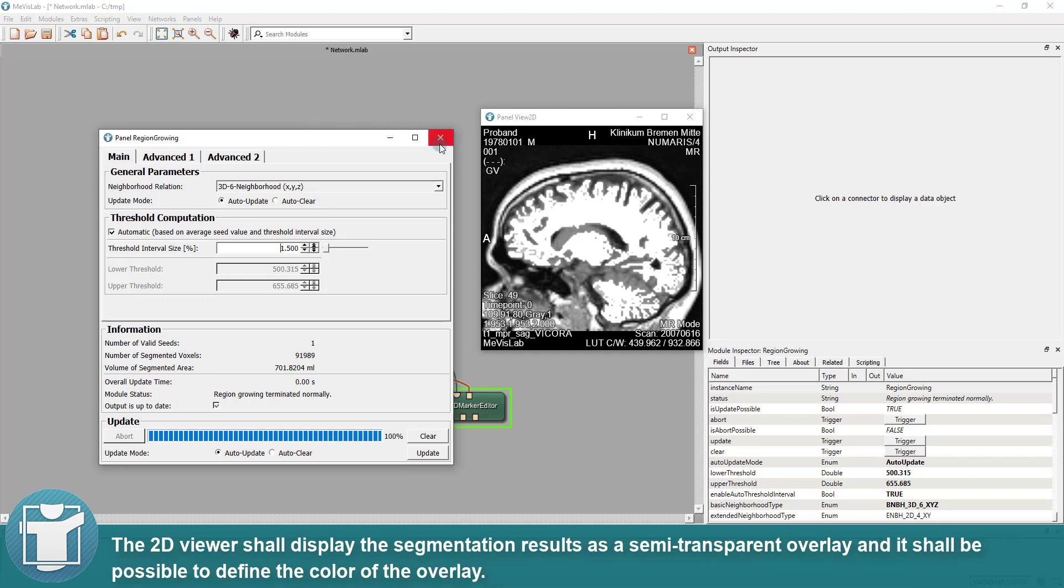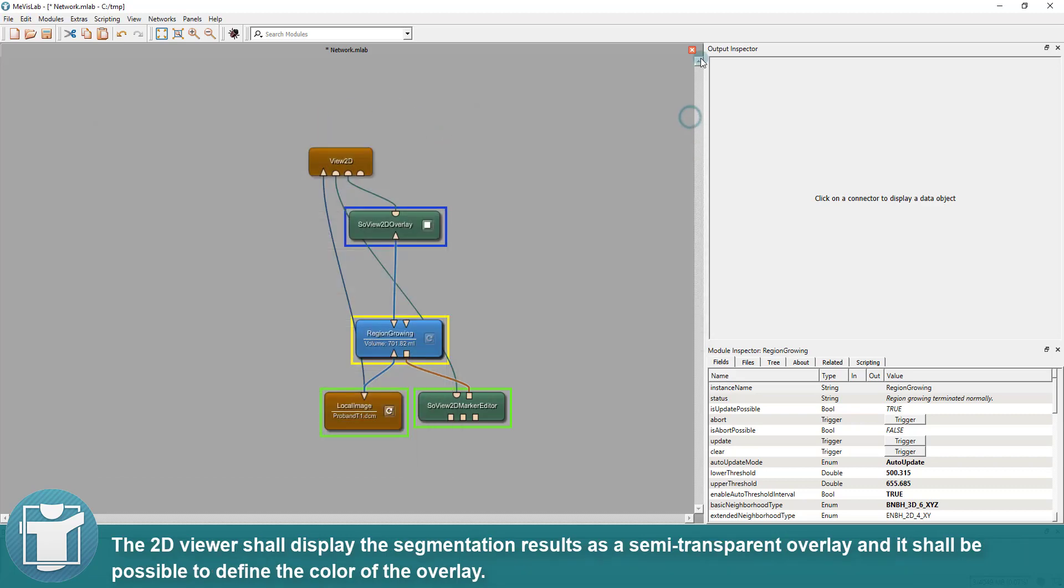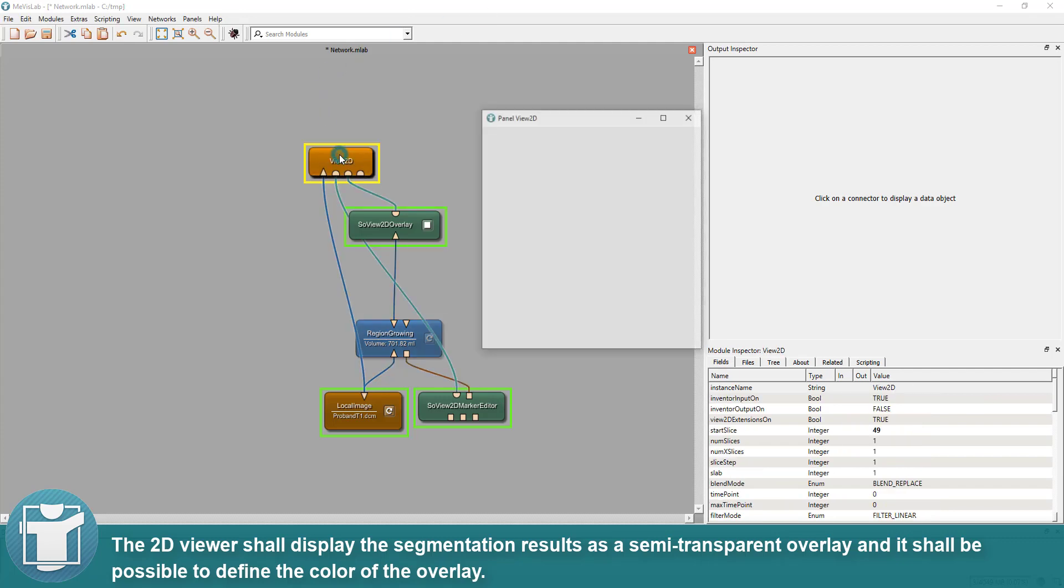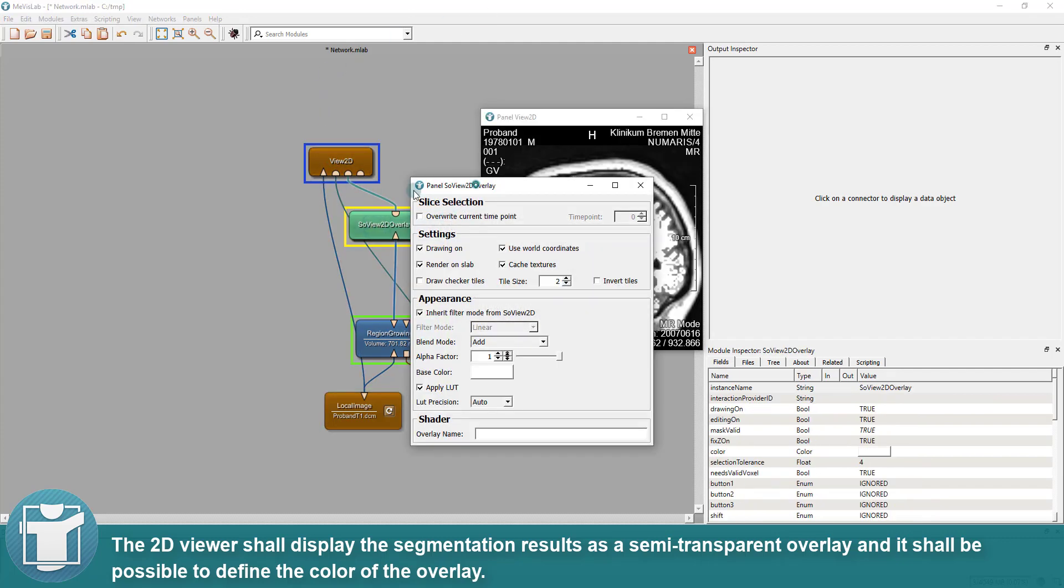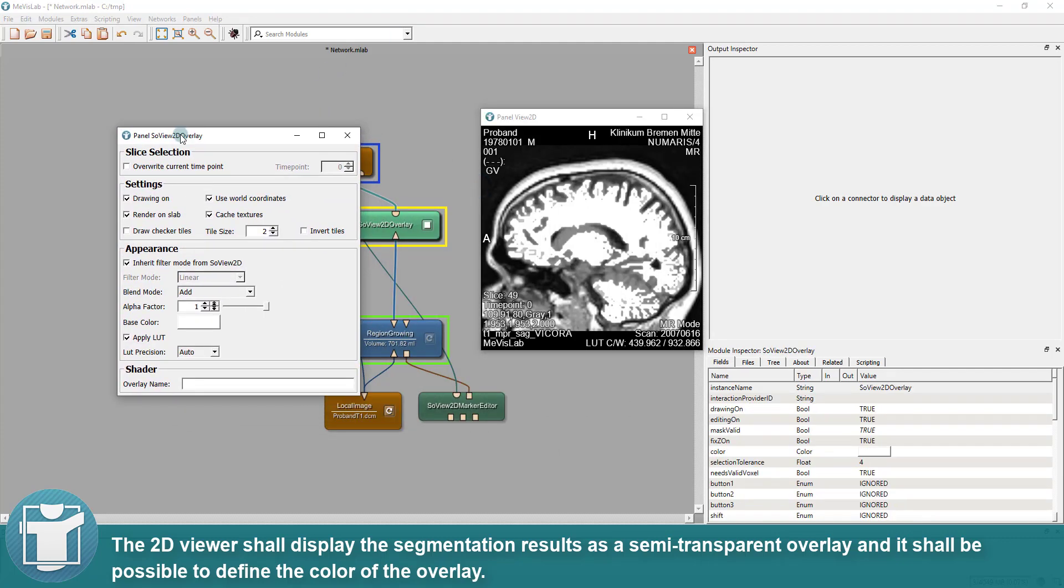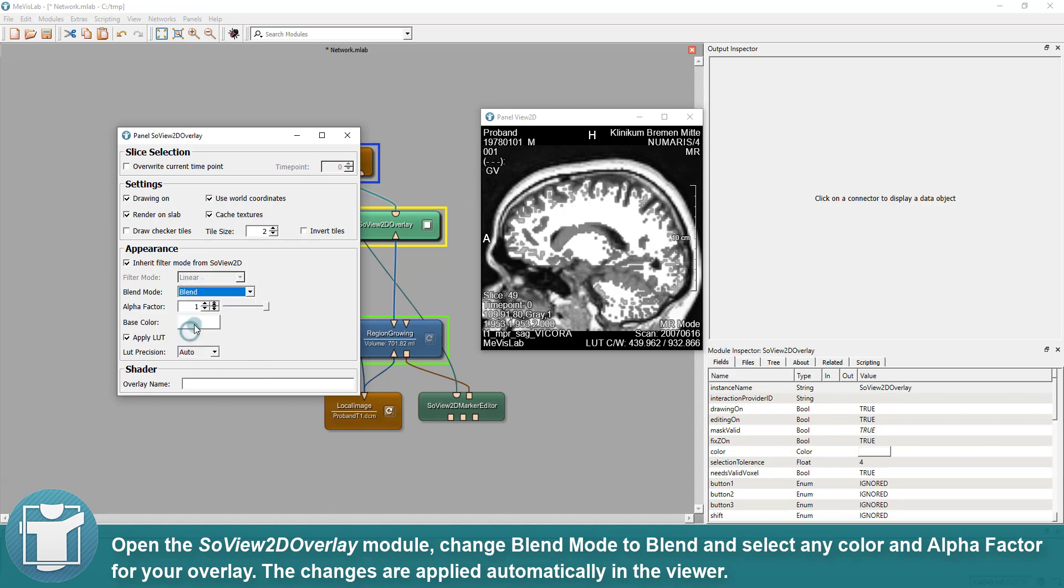The 2D viewer shall display the segmentation results as a semi-transparent overlay and it shall be possible to define the color of the overlay. Open the SoView2D overlay module, change blend mode to blend and select any color and alpha factor for your overlay. The changes are applied automatically in the viewer.